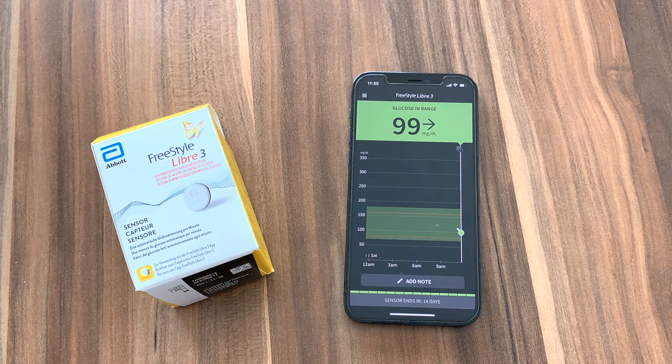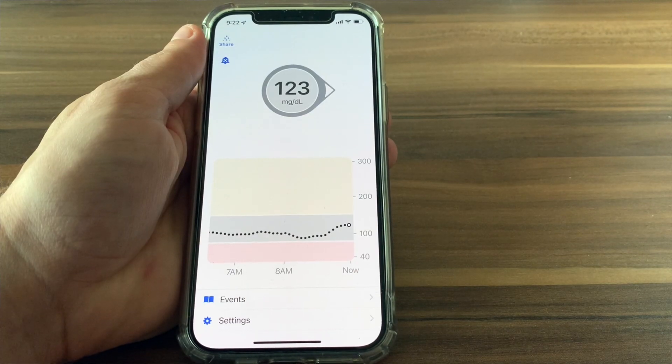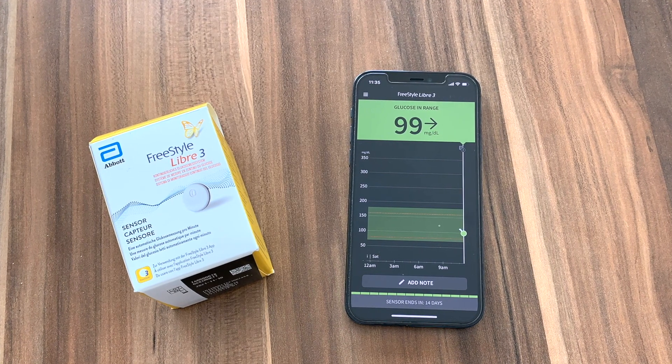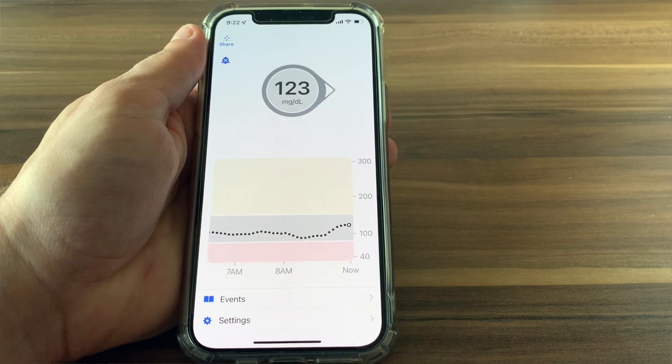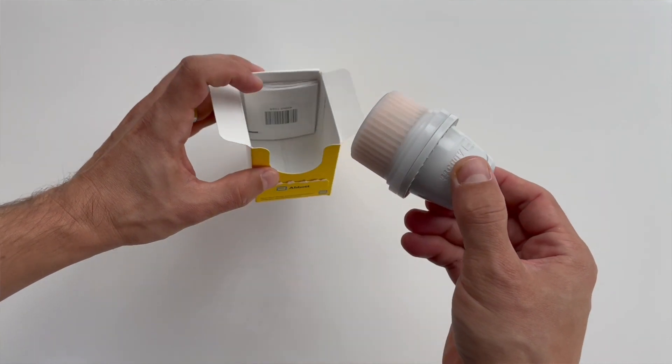Next I want to talk about how easy or difficult it is to apply, use and remove these sensors. Both of these solutions are true continuous glucose monitors, and so they automatically feed all glucose data from the sensor directly to your device via Bluetooth. They are really user friendly because you simply see your glucose data on the screen at all times. There is no more scanning of the sensor to transfer the data, which was the case with Freestyle Libre 2. Both systems tell you what your glucose is right now by showing you a number, where it's headed by showing you a trend arrow, and where it has been in the past few hours by showing you a graph. When it comes to sensor application, Abbott was able to reduce the number of steps needed.